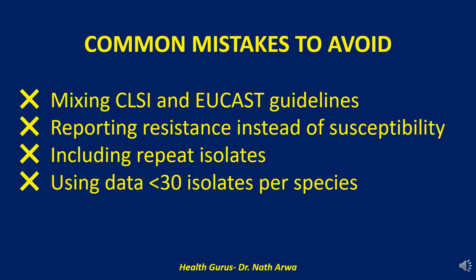First up, don't mix your breakpoints. Using both CLSI and EUCAST standards in the same antibiogram. That's a no-go zone. These two systems use different breakpoints and methodologies. That means an isolate might be susceptible by CLSI, but resistant by EUCAST. Mixing them leads to inaccurate susceptibility rates and confusion.